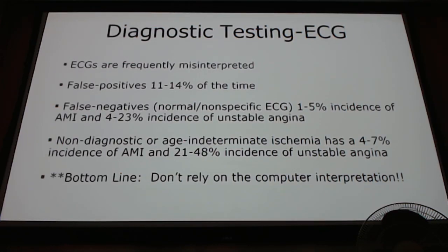Yes, EKGs are frequently misinterpreted. We never rely on the computer interpretation. It is helpful for your rate and some of your measurements for your waves and your segments. But we still misinterpret them very frequently. Nowadays we have newer machines that are pretty good. And we do studies on this all the time with the latest AI that comes out, how well it translates versus an ER physician reading them, and they're relatively close depending on what machines you have. But we also want to interpret ourselves because we can still miss quite a few things, and as you can see by the percentages, we do miss them.